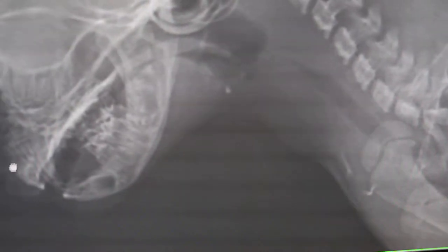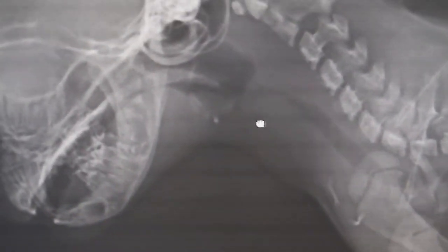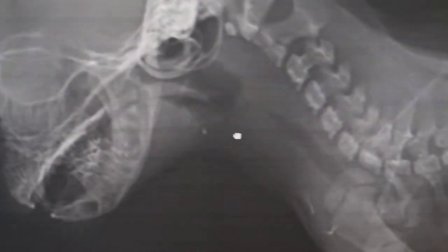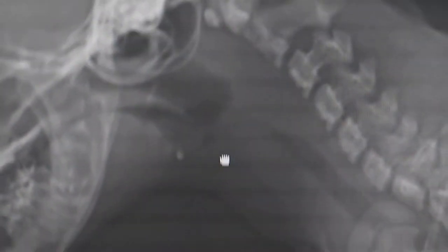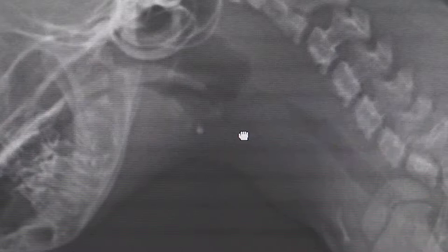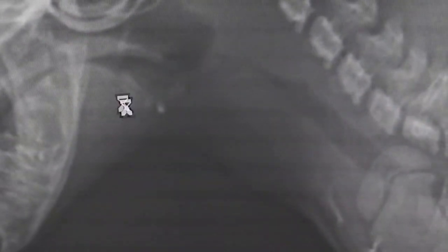This is a kitten, 1 month old. Very painful throat. The throat was very painful for the last 2 days, couldn't suckle. So the owner came. And actually, you can see the throat. There's a big inflammation or ulcers there. Normally, you don't see such a big diamond shape gas inside this throat behind the tongue. Normally you don't see this big rectangular mass.